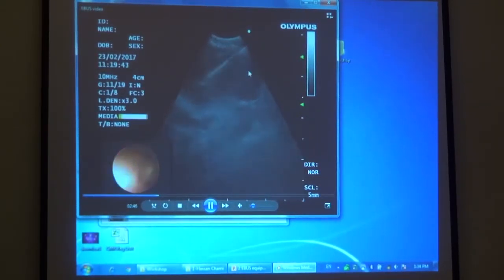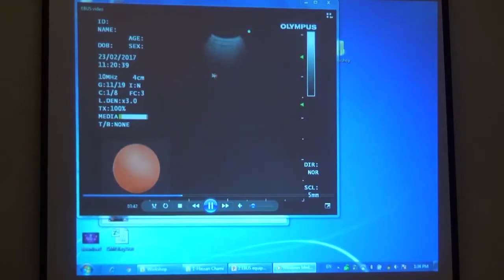I'm not sure if it's going to do it, but here you can change the angle by relaxing your thumb. You can change the angle of the needle and do a fanning technique. So you do it about 20 times over. So they were back to ultrasound while they're working on the samples. Here you go into the right main stem, and again he's trying to get the main stem. So you saw an expert here, my fellow is doing it.